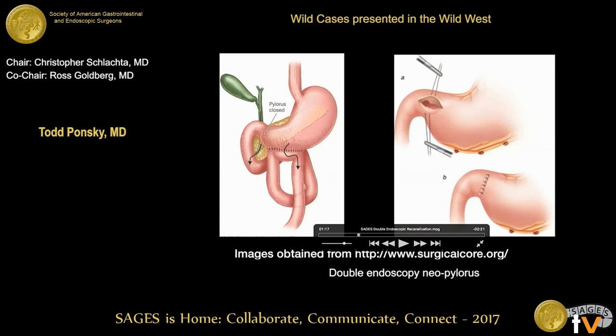Fair enough. We put an endoscope down, and not only is there no opening, we can't even really tell where the staple line was. It's almost completely just a big sack, and we cannot see any evidence of an outlet possibility opening. Okay, would anyone do a pyloroplasty? Maybe laparoscopic, open pyloroplasty? All right, let's see what we did here.